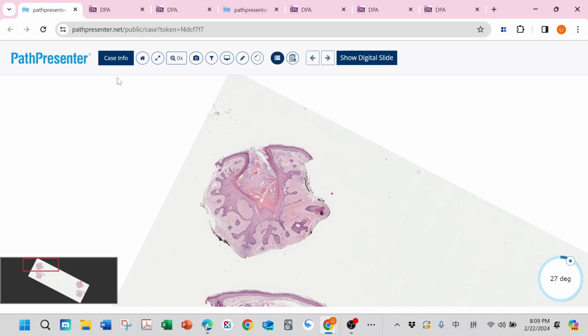And then let's see another entity for this one. Because they are in the same family, usually they will be put together, but this one is easy to make the diagnosis, you just need to pay attention to the previous one. From the baby and mother follicle, that one is trichofolliculoma, and this one is fibrofolliculoma.